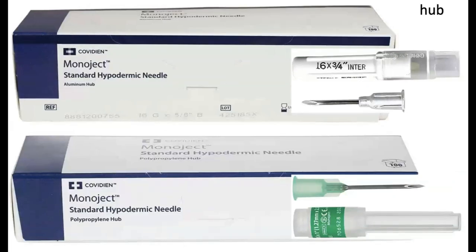The hub is another consideration. The two most common hubs we'll see will be like the one on the top here, that would be an aluminum hub, versus a plastic hub. The aluminum hub needles are slightly more expensive than the plastic hubs. But when we think about BQA and making sure we don't break a needle and get in a situation where we're trying to remove a needle from an animal, we really want to look at those aluminum hub needles. Especially if you're using a multiple dose syringe, and we'll talk about those later, definitely need an aluminum hub in that situation. You'll see both of them there, but that aluminum hub is going to be a better choice.